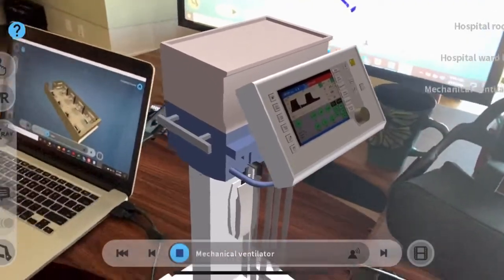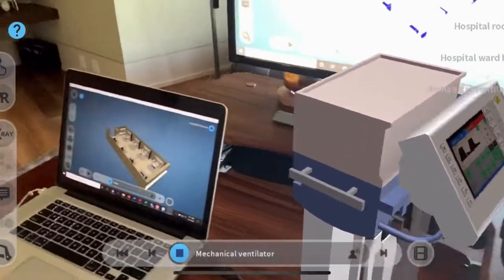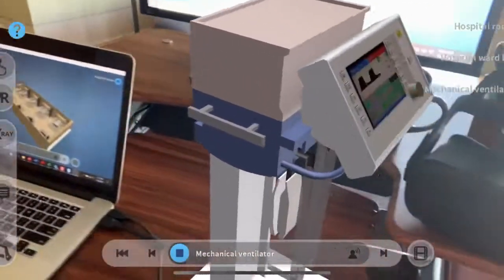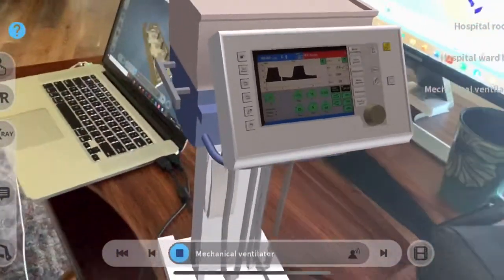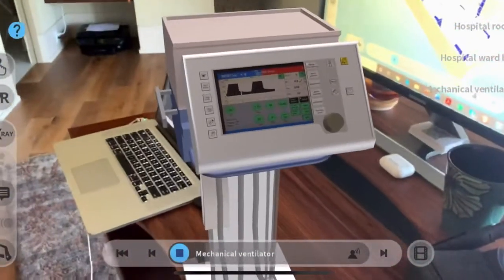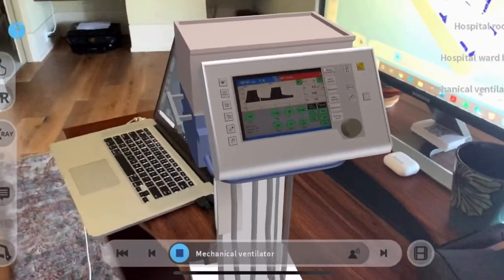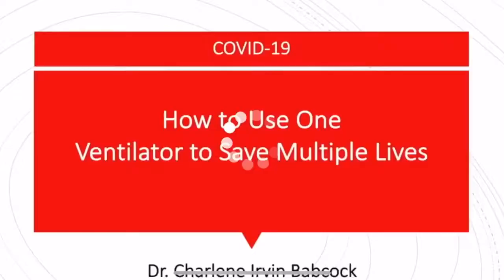What is a mechanical ventilator? A mechanical ventilator is a machine that helps a patient breathe, ventilate, when they are having surgery or cannot breathe on their own due to a critical illness.